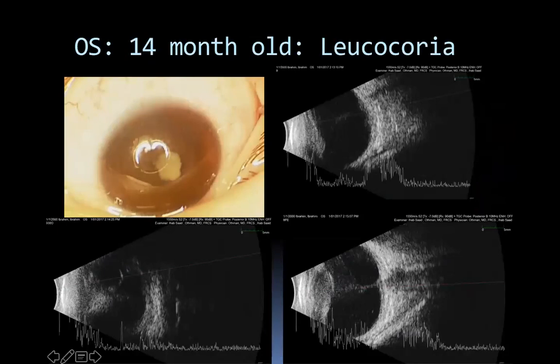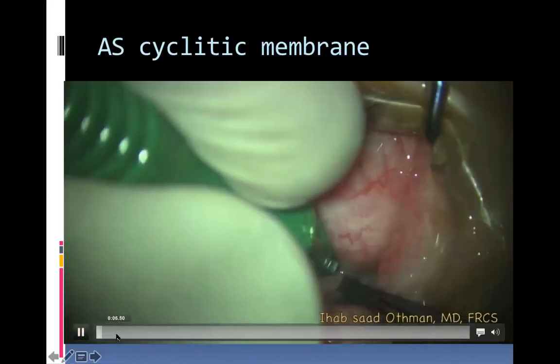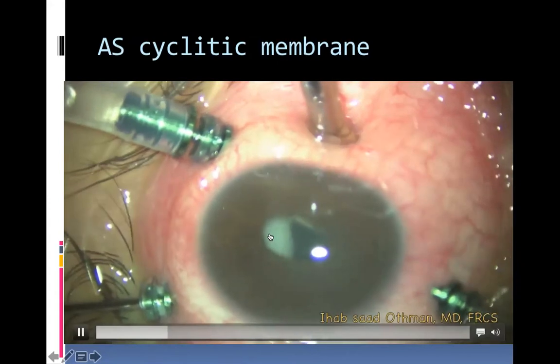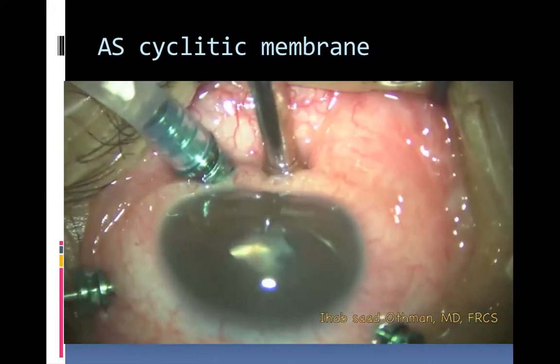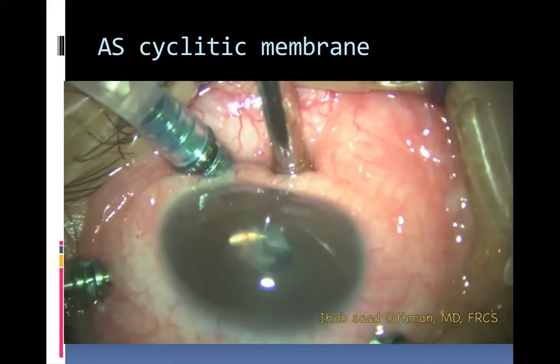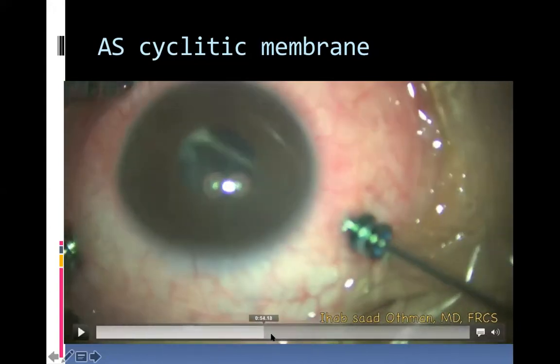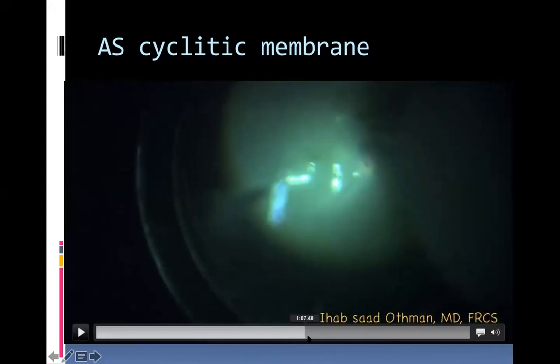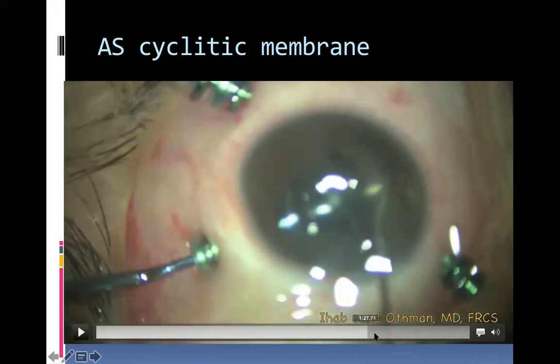Metastatic endophthalmitis is important, and it's important to know that maybe we can help if we are not absolutely sure that this has no mass. The difficulty was in the cyclitic membrane. The endophthalmitis ended up inducing the cyclitic membrane. By releasing the traction and the cyclitic membrane, we could do something in preserving the health of the eye. As you can see, it's really difficult to remove it, and the induced traction on the periphery has to be really released. The posterior segment is absolutely nice, and we can really improve the outcome by performing surgery.